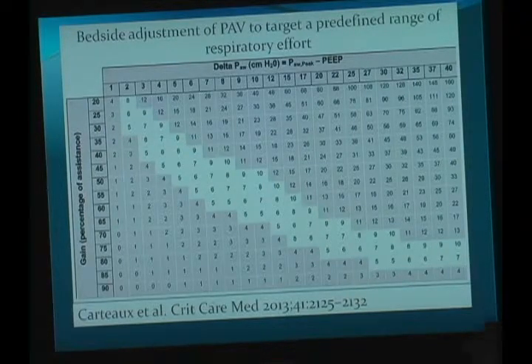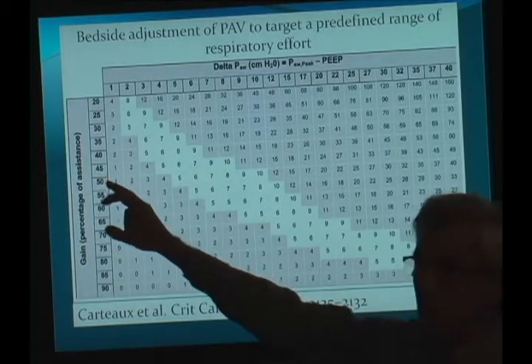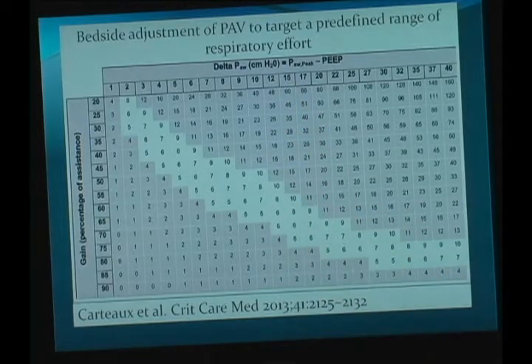So we have to decide what percentage of help you want to use, depending on the mechanics, what can be the pressure developed by the patient to avoid also atrophy. If we use 100% of help, they will be atrophic. So we have to move between atrophy and exhaustion.